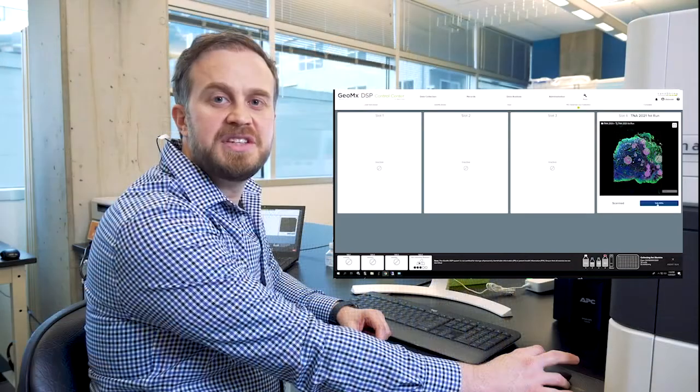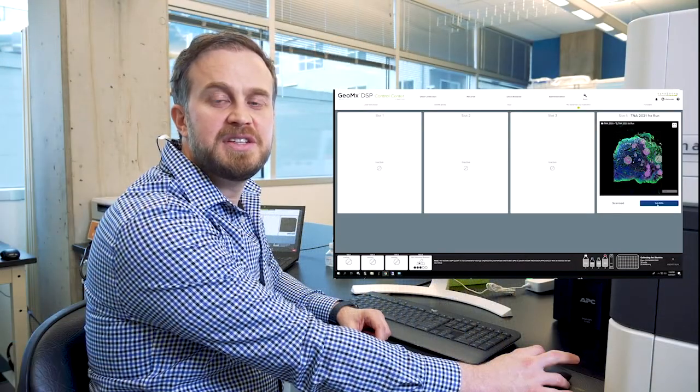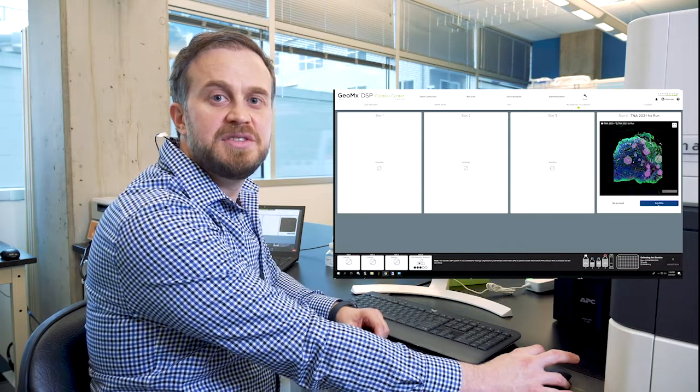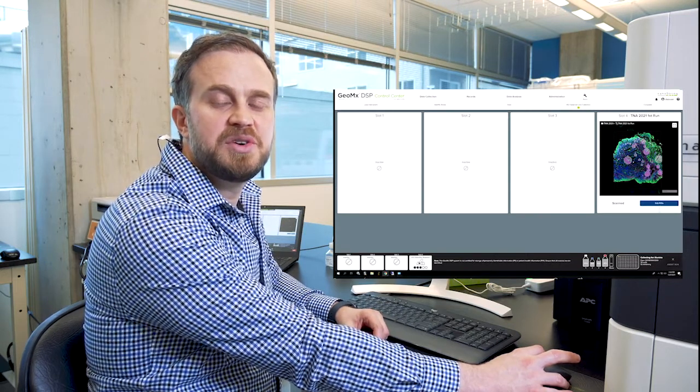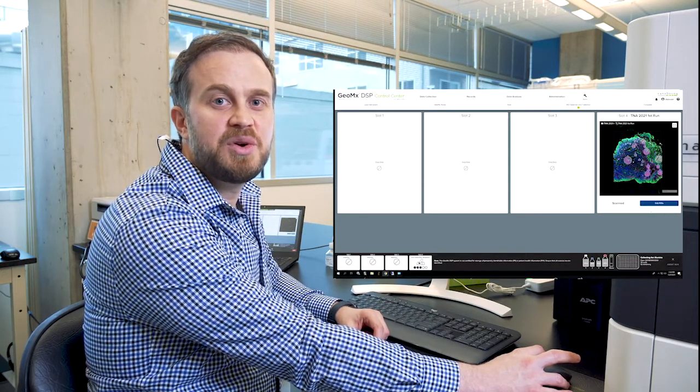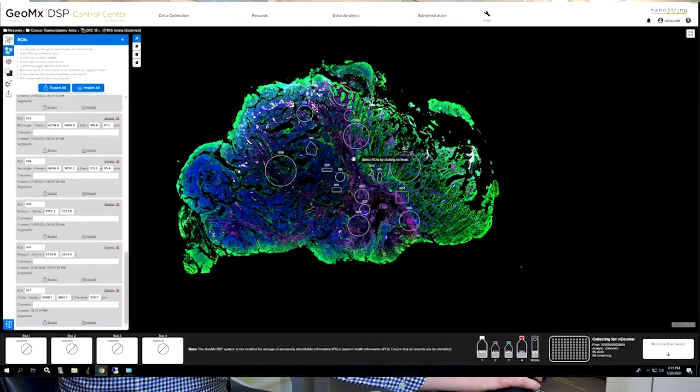Welcome back to the CX Lab experience. During this session, we will cover ROI selection and segmentation on Geomix DSP. A fluorescent image with up to four colors is generated to enable selection of region of interest or ROI on the tissue.